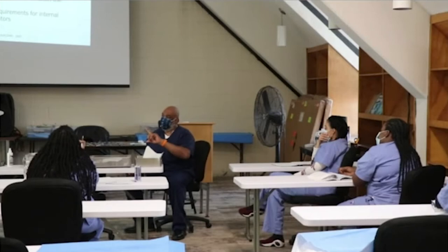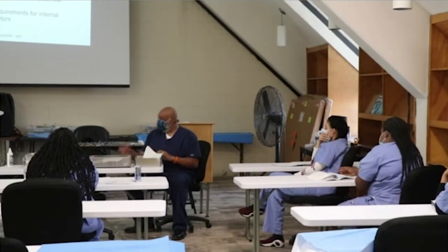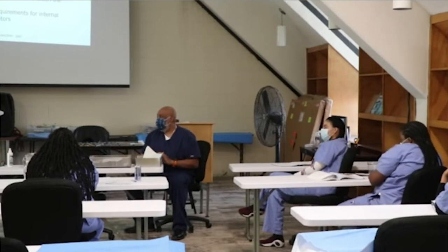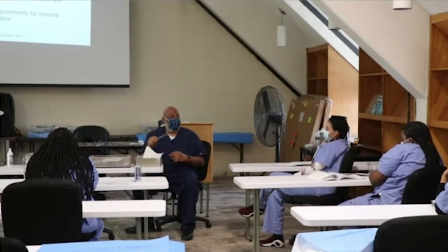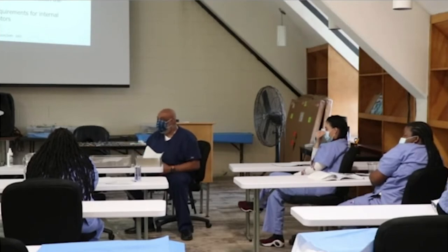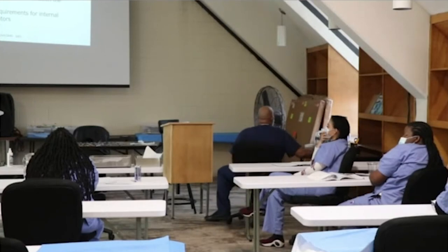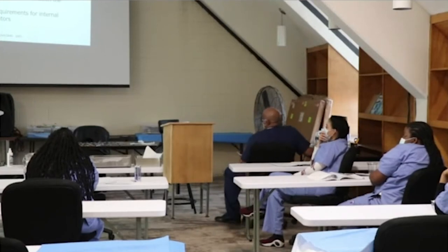But the other important thing is you want to make sure that it's the correct one. Look at the number on the cord, look at the number on the count sheet. How can I defend you if it clearly says 007 and you put in 027? She didn't have her glasses on. Then why didn't she use the magnified light? See what I'm saying? So always go for accuracy. Speed is going to come.